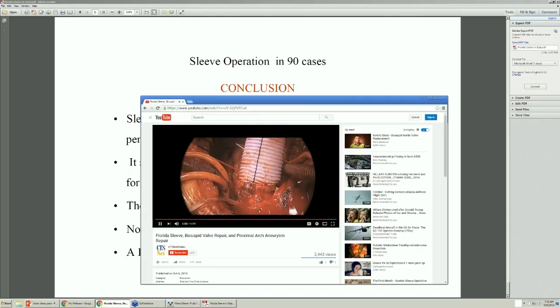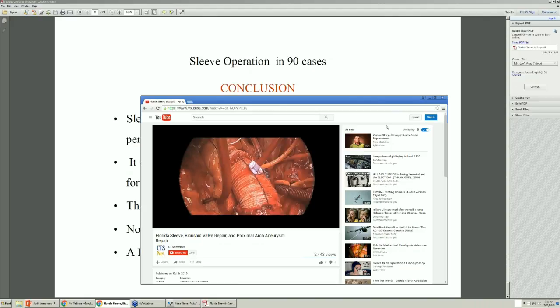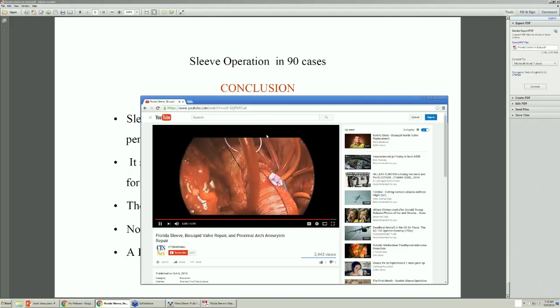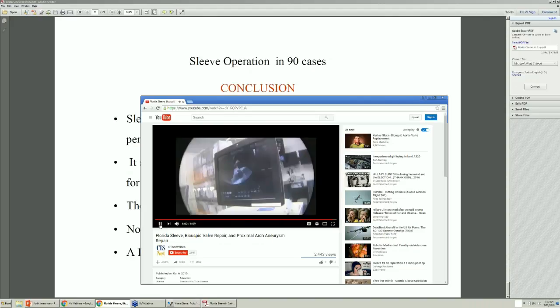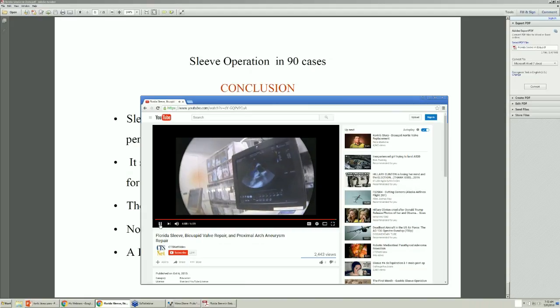The aorta is being unclamped and reperfusion is being initiated. Graft-to-graft anastomosis roughly at 11 or 12 o'clock, looking quite well and rather hemostatic, as is usually the case. And finally, we look at the completion echo, which shows no residual aortic insufficiency and a valve that had single-digit gradient.